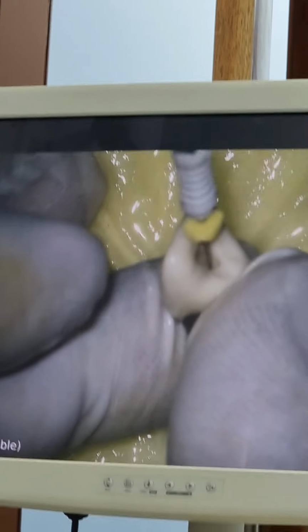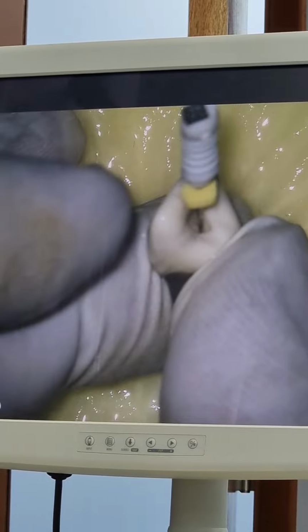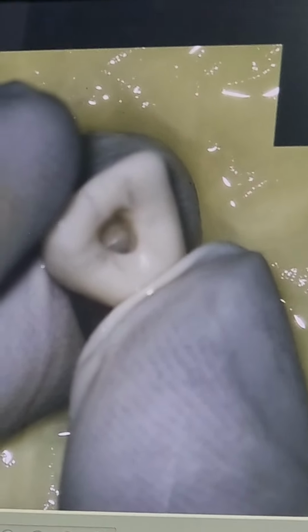Here, you can't see, but I can feel the lingual wall putting pressure on the file. If I take an X-ray, it will be the same as the initial X-ray I showed you. There is pressure on the file from the lingual wall, which is pushing the file more buccally. This can be a cause of problems later on: inadequate compression of the lingual wall, and even fracture of the files.